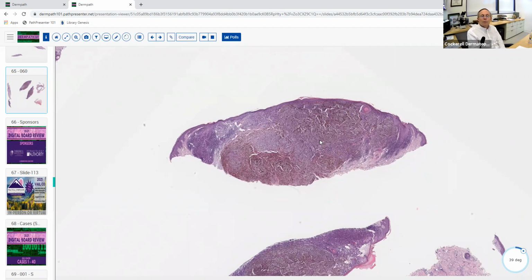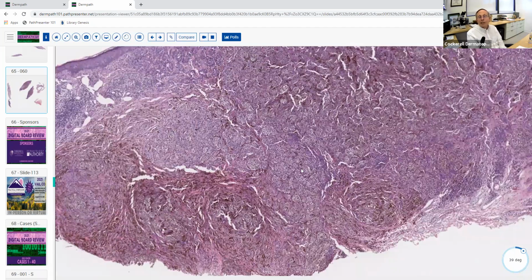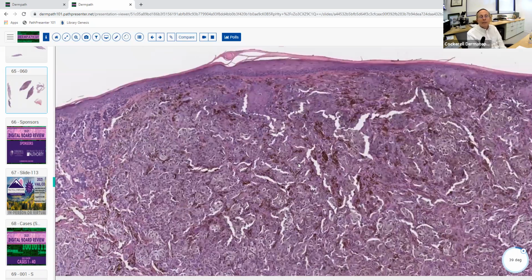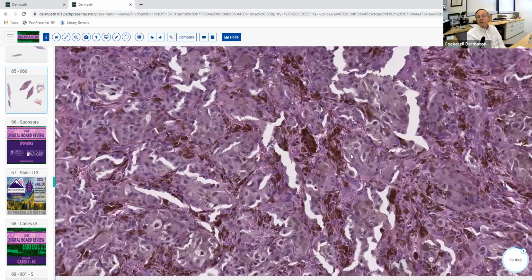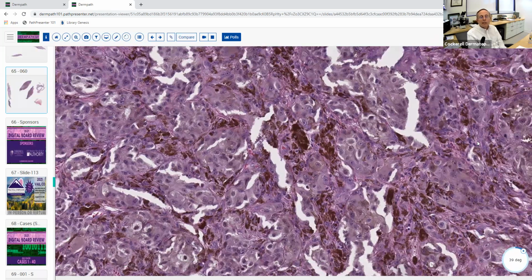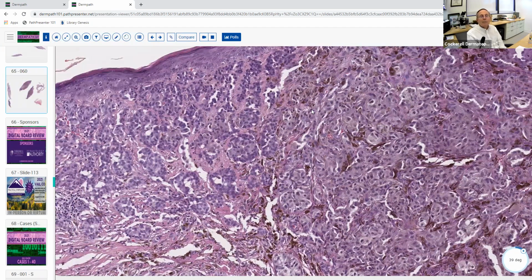So we're going to favor melanoma, and we're going to say, well, can we talk ourselves out of it? Is there anything else that can do this other than malignant melanoma? So we're going to go down to higher magnification. Somehow we see something in here that it's not even melanocytic, and maybe this is exogenous pigment or something like that. Well, maybe, but no, we're going to higher magnification. These cells are strikingly atypical. They're pleomorphic. They vary in size and shape. They have an increased nuclear cytoplasmic ratio. You've got asymmetry at high magnification with these different populations of cells.